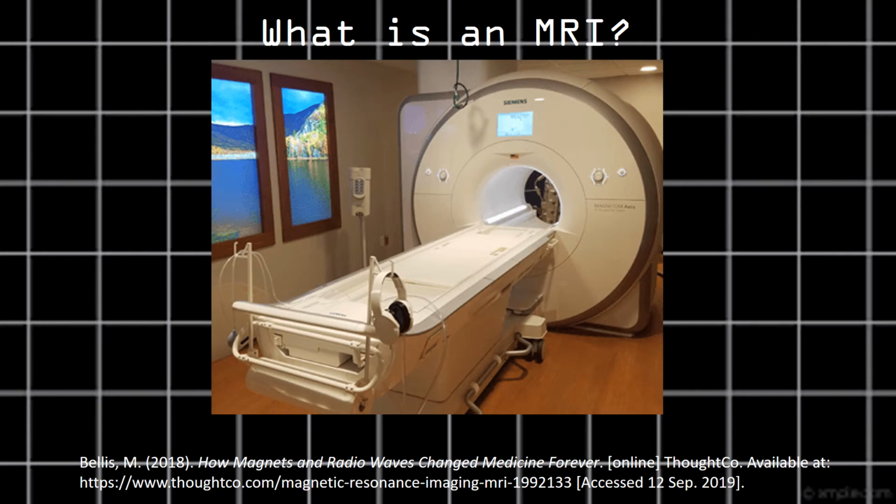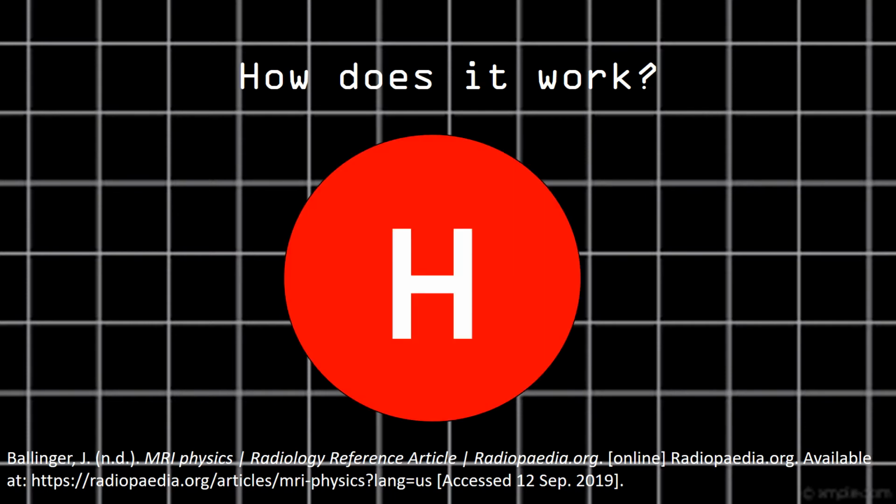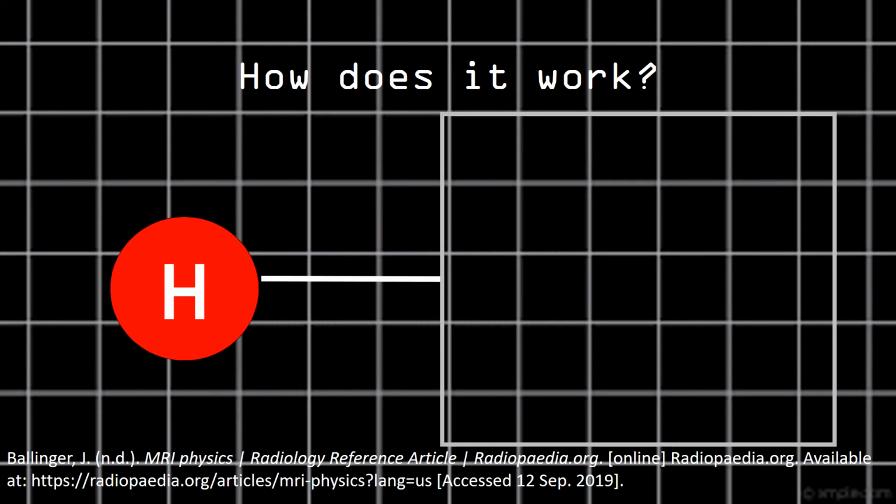An MRI is short for magnetic resonance imaging, and as the name suggests, uses magnets to produce cross-sectional images of the body. So how are magnets able to produce a cross-sectional image of your body? Well, we first have to look inside our bodies, particularly the hydrogen atoms in the water of our bodies, and even more specifically, the protons of these atoms.